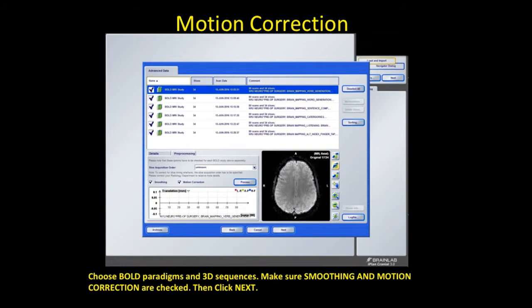Here's the motion correction step. Choose bold paradigms and 3D sequences, and make sure smoothing and motion correction are checked, then click next.